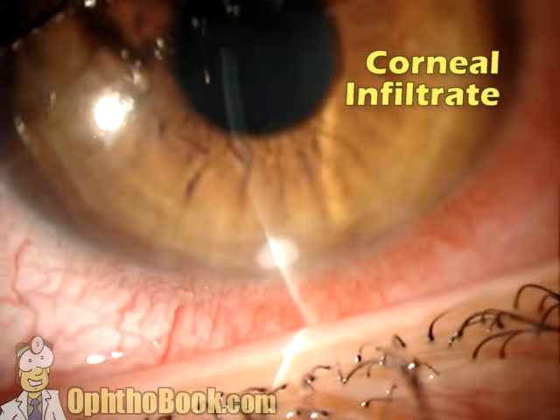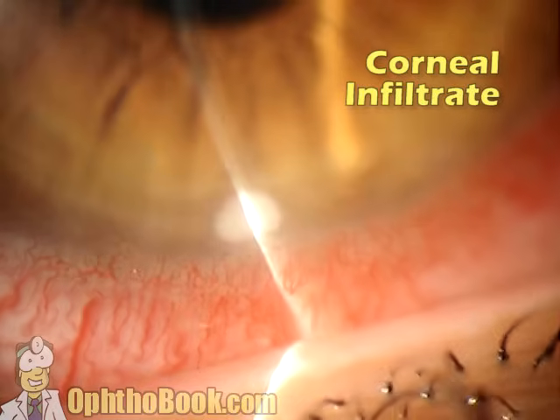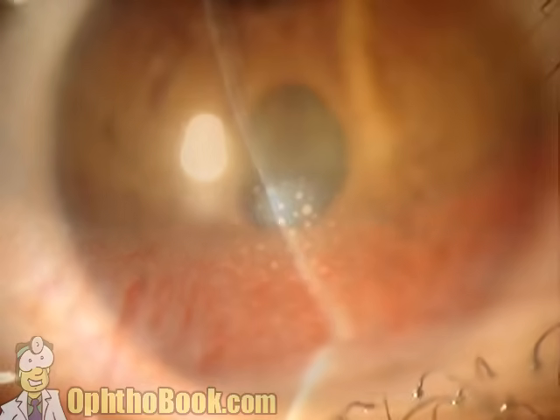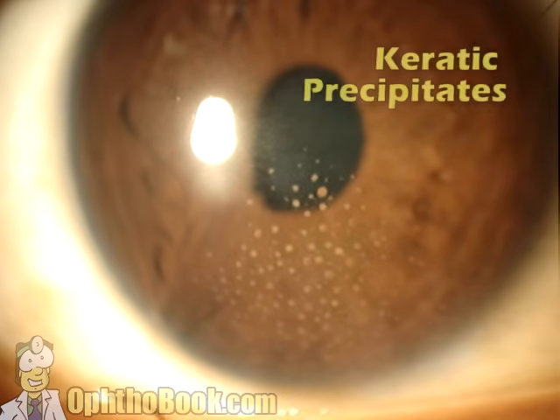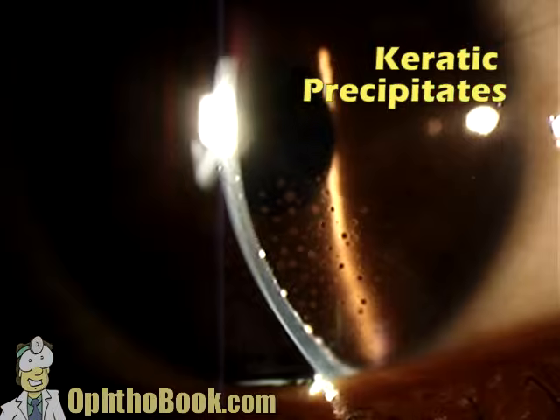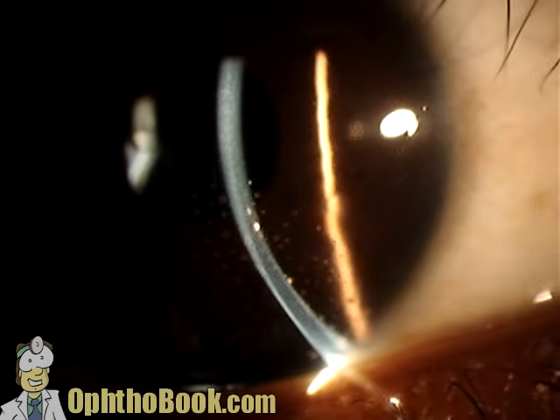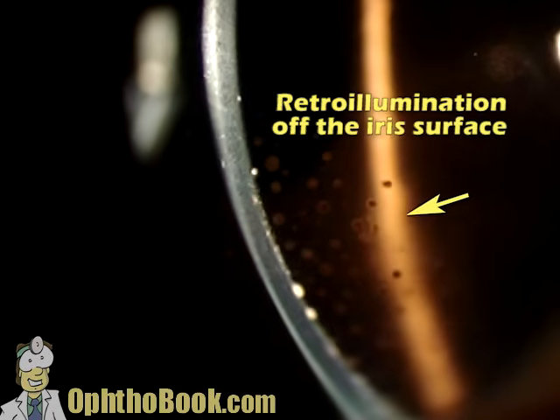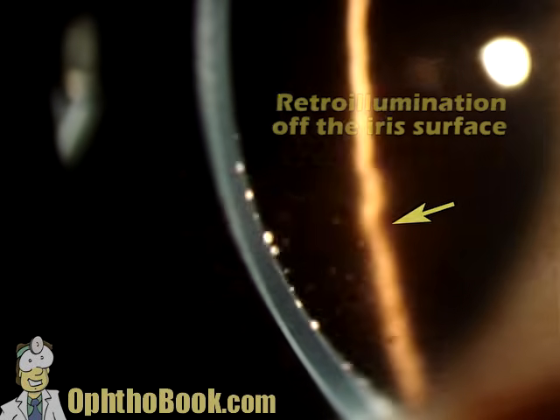This is a corneal infiltrate, probably related to contact lens use. And it's on the front of the cornea. You can kind of tell just the way that it lights up. Very amenable to antibiotics. This is KP splattered on the back of the cornea. And we know it's on the back of the cornea because we can use our slit beam. Once again, you can see how it lights up on the back surface. And you can even use retroillumination off the iris to see those dark spots by looking at the bright iris as a background.